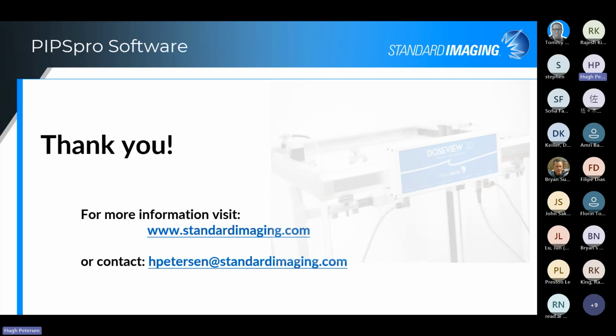The other one: what is the mechanism to measure the focal spots for CT Sim? Actually, we don't do focal spots with the CT SimCheck Phantom. That's something you would use a different, focal-spot-specific tool for. So we don't do that within the CT SimCheck component of this Phantom and software yet. That might be something we can add to our roadmap later on. We'll have to do some more research on that.